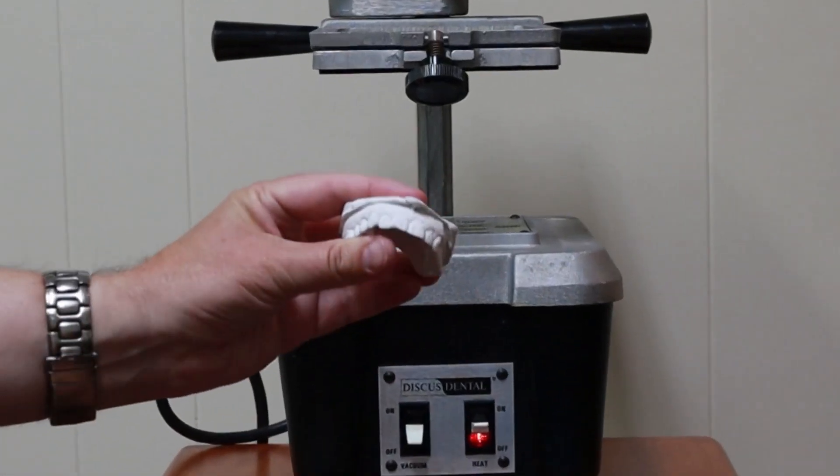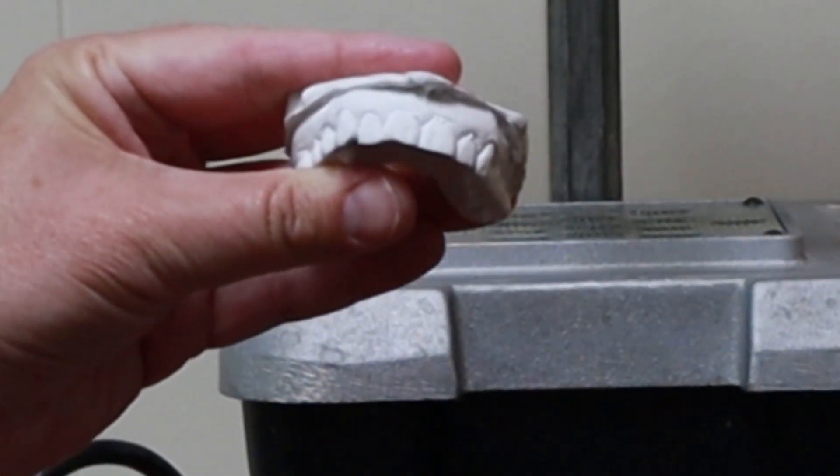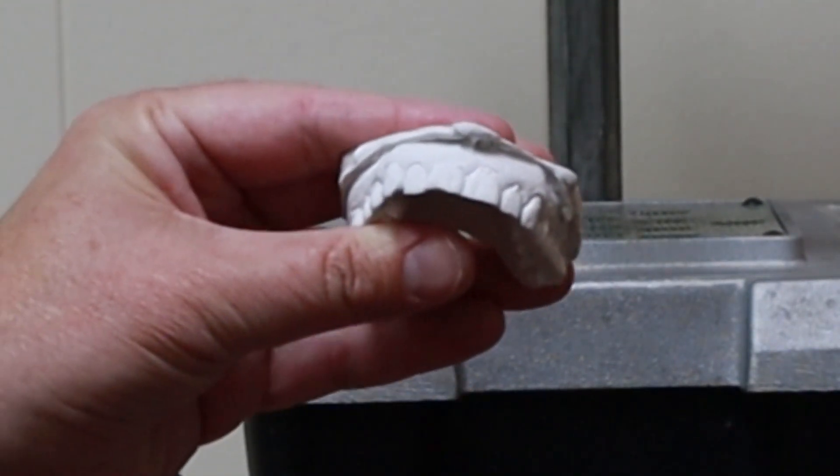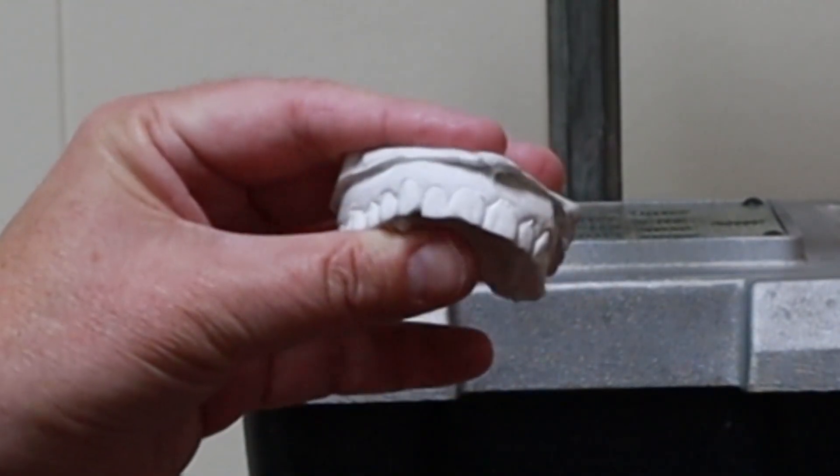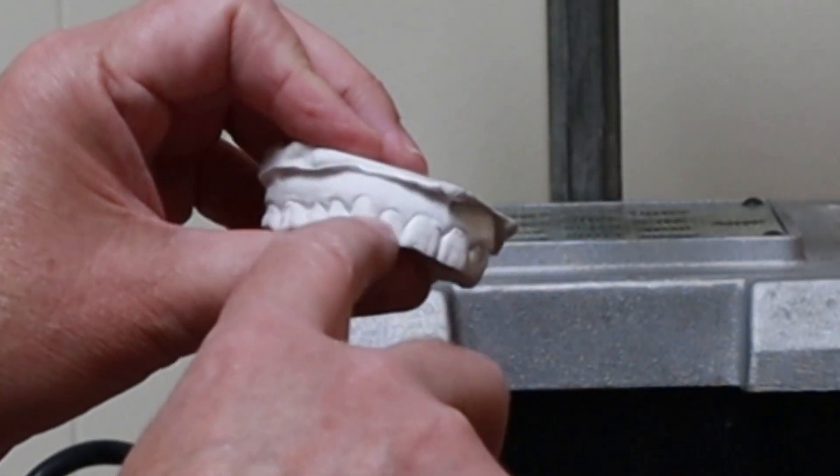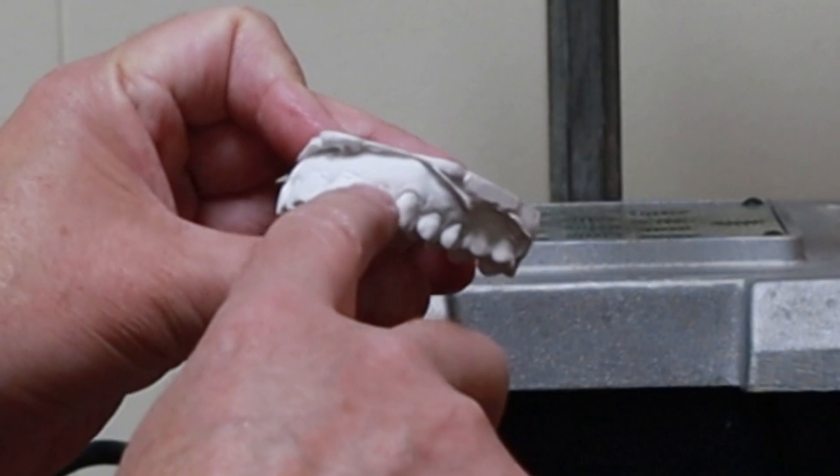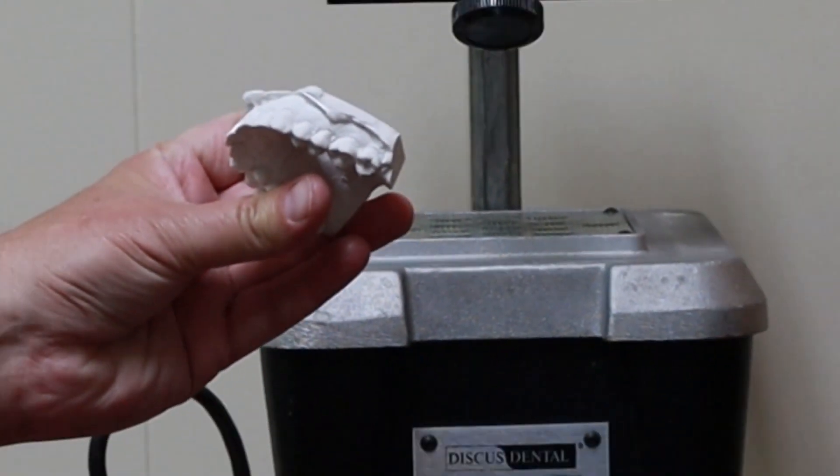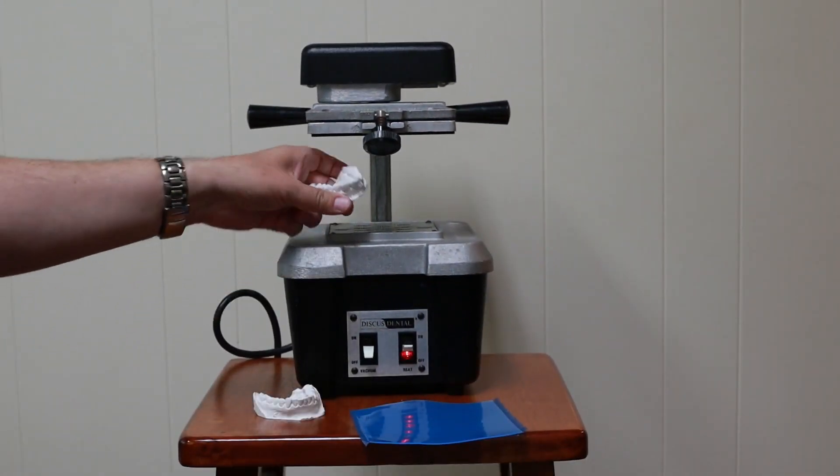One thing that I do that I learned from Dr. Rod Kurthy, the dentist behind Core whitening products, is taking a dull instrument and gently tracing over the gum line. That way you'll see a line on the plastic when you go to trim it.